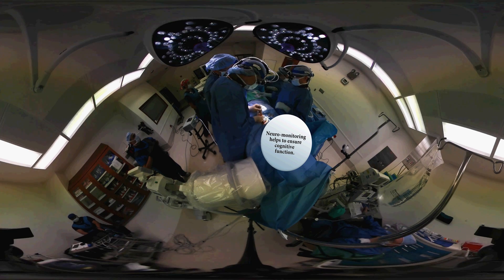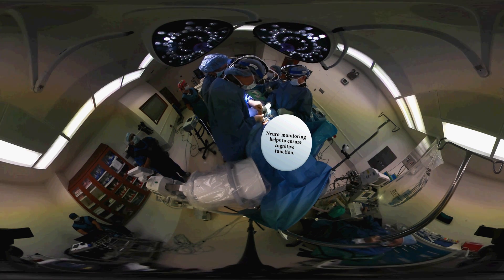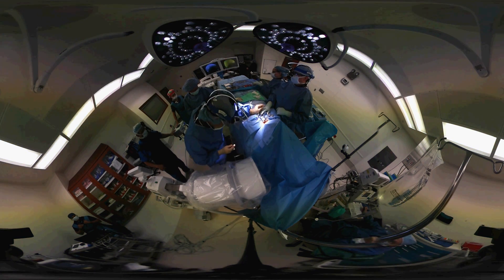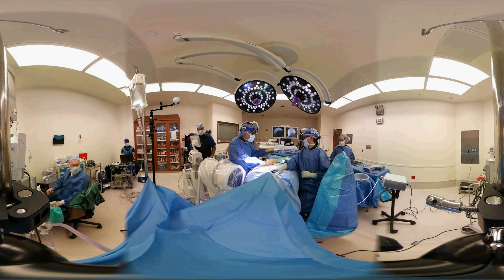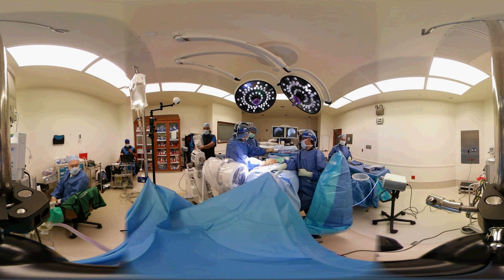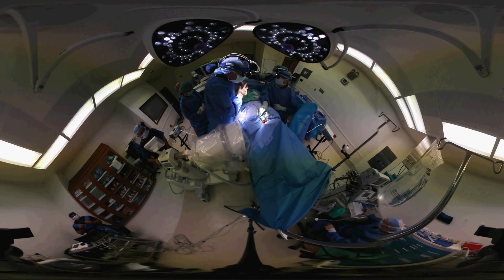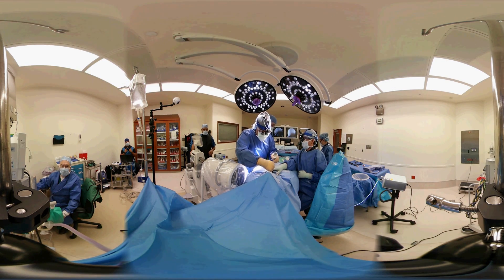We use neuromonitoring during the course of surgery to make the surgery safe for the patient, so that if I irritate a nerve they will let me know because they will see an abnormal signal on the computer. If you move the screen you may be able to see the neuromonitoring tech off to the left behind me. We're just checking the x-ray to make sure we have the pins in proper position — it is these pins that allow me to distract and clean the space out.